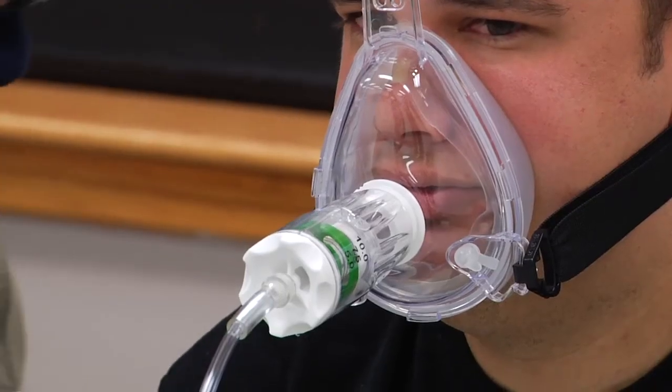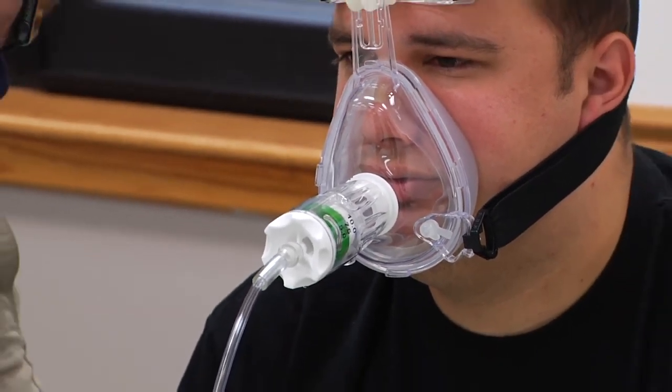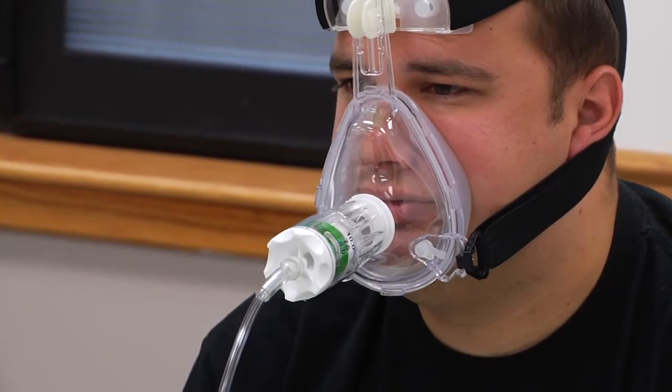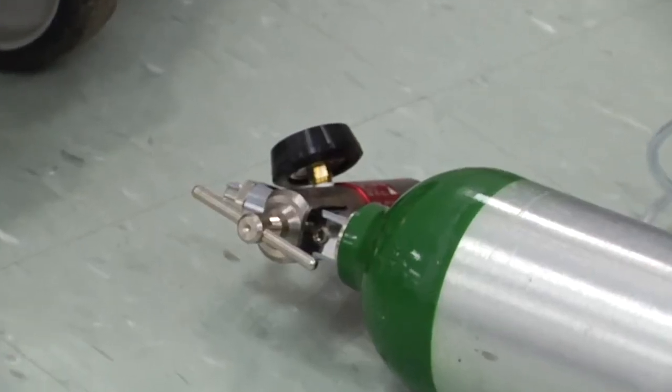After about 20 minutes, and 20 minutes is a reasonable period of time, if those numbers aren't changing in your benefit, you may try increasing the pressure over that 20-minute period of time. But after 20 minutes, if you've maximized your therapy, you're at as much pressure as the patient can tolerate, and you're not getting anywhere, it's time to stop using CPAP and go to some other form of respiratory support.